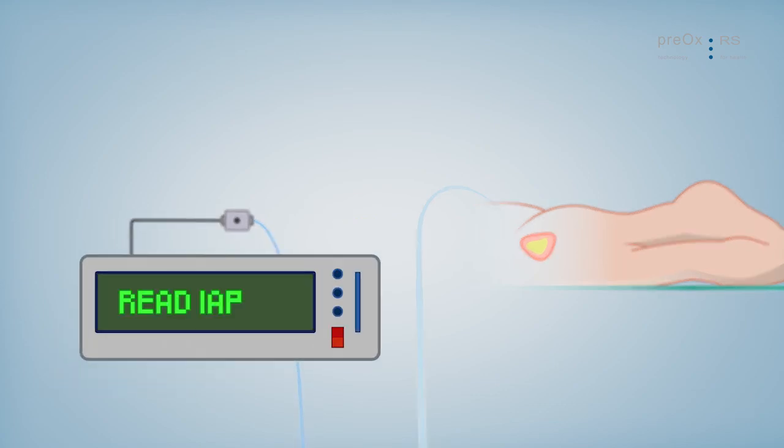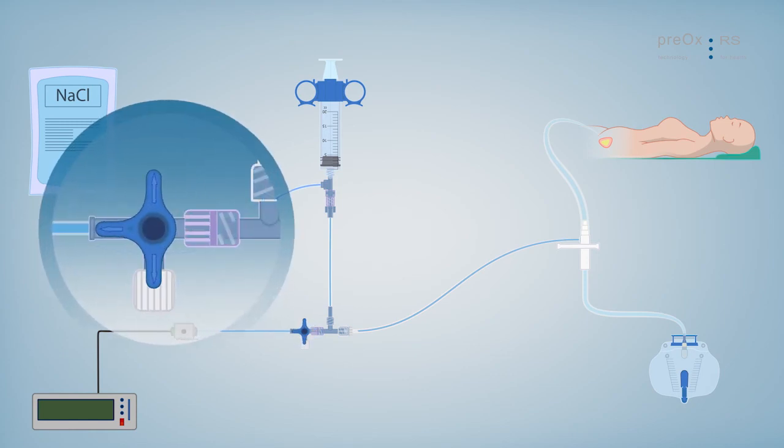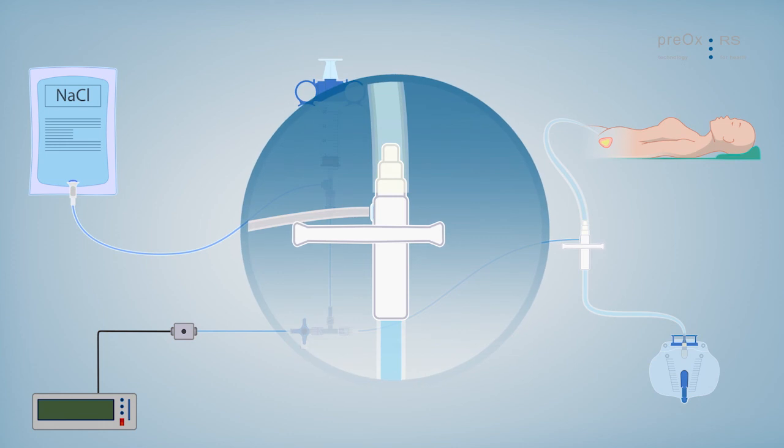Now you can read the intra-abdominal pressure from the monitor. Close the three-way stopcock and open the white clamp of the IAP adapter.